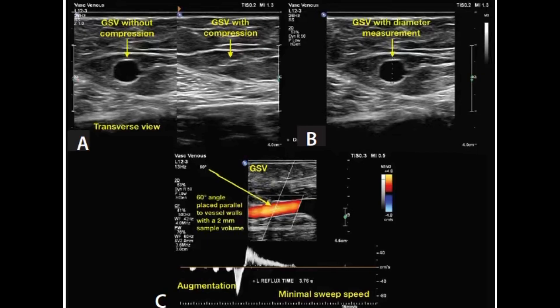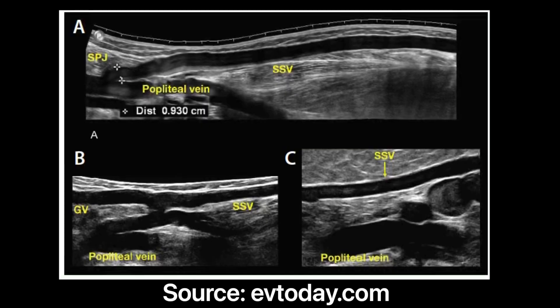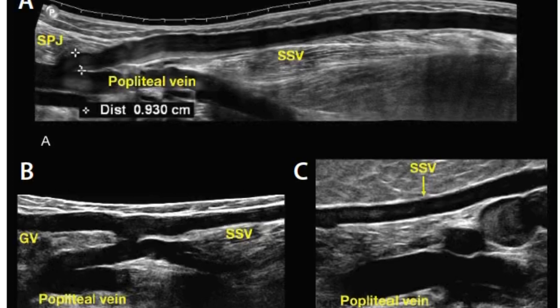Next, go on to the small saphenous vein. Take grayscale and colored Doppler images. Compression. Check for reflux. Reflux lasting longer than 0.5 seconds is a positive finding. While scanning the small saphenous vein, check for a Giacomini vein, which is a cranial extension of the small saphenous vein that communicates with the great saphenous vein via the posterior thigh circumflex vein.